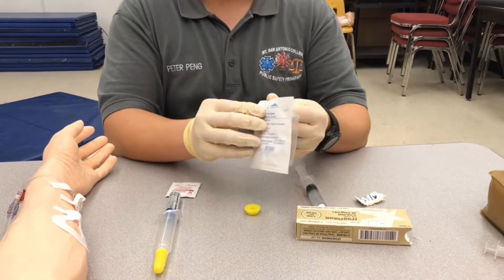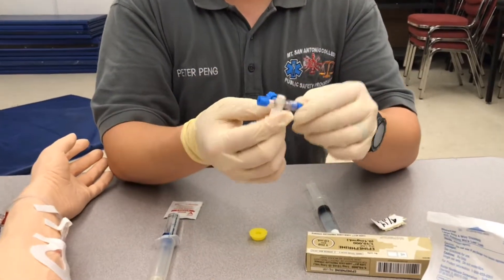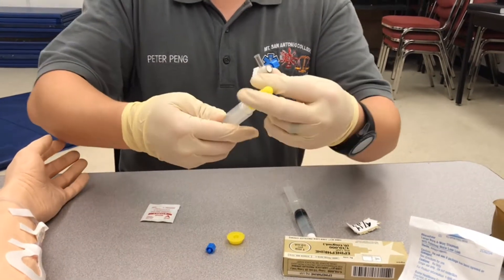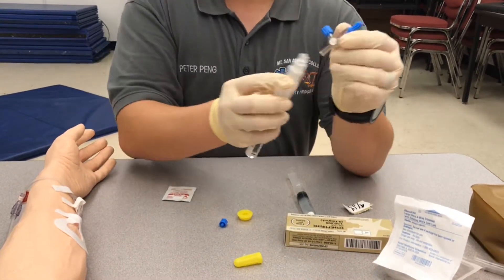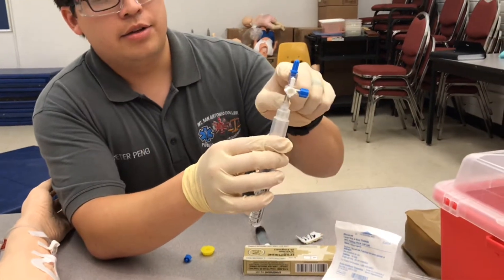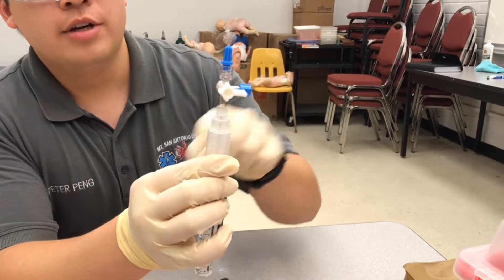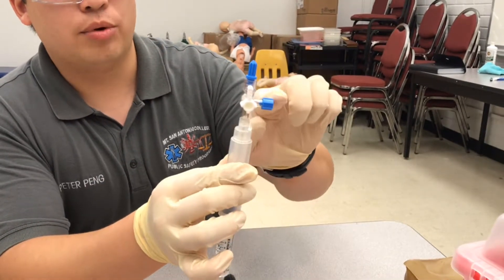Now I'm going to open up my three-way stopcock. Make sure you keep the caps on if you're not using them. We're going to be using these two ports for now — these are both the female ends and this is a male end. First we're going to hook up the epinephrine and screw that on. With the three-way stopcock, there are three directions fluid can go and this white lever can move to any of those positions. Wherever the long part is, it says off. So right now this port is off. I want these two ports to be open.